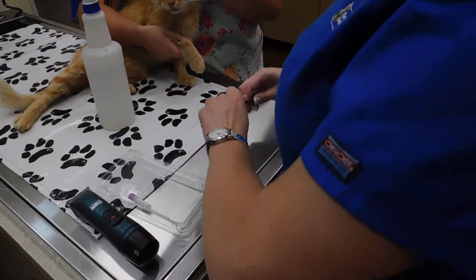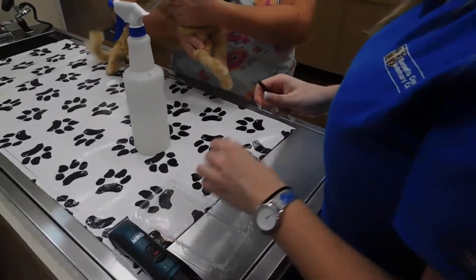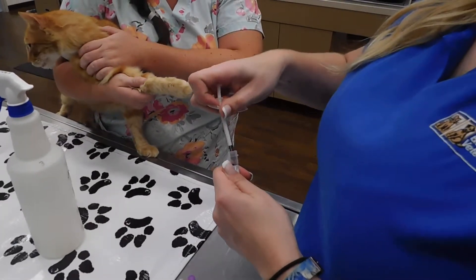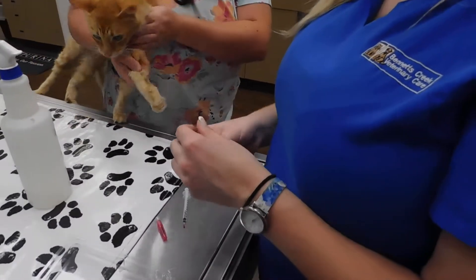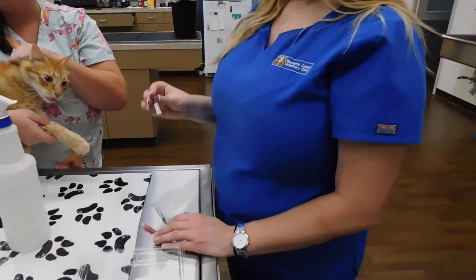I'm going to go ahead and put my 0.5cc — you can see that it is 0.5 — sample into my tube. Like I said, we don't have a vacutainer for the sample, but if we did, all I would do was insert the needle into the tube and let it pull up the amount that it needs without pushing the plunger in, and it pulls up the exact amount it needs.